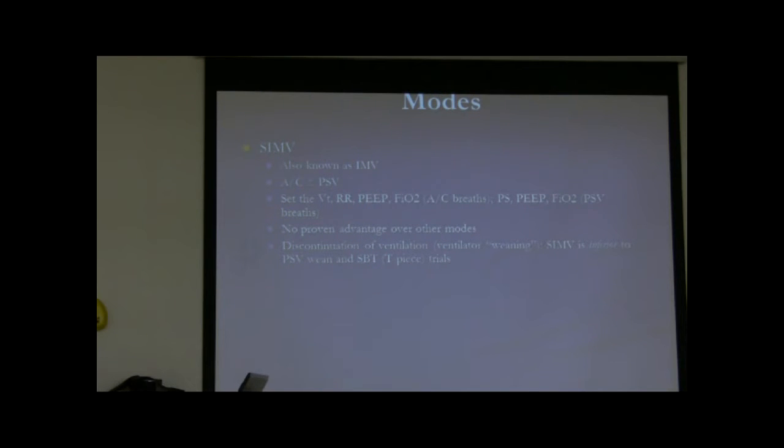Why is that? Because the brain can't tell and the diaphragm can't tell which is a spontaneous breath and which is a mandatory breath. So it ends up actually delaying the whole weaning process. So as a rule of thumb, I actually never use SIMV because I don't think it adds anything to other modes. It's certainly not better, and it may be worse. Okay? So rarely used.